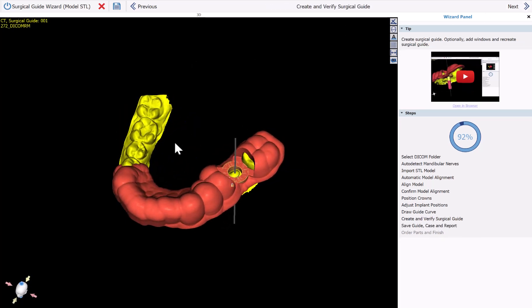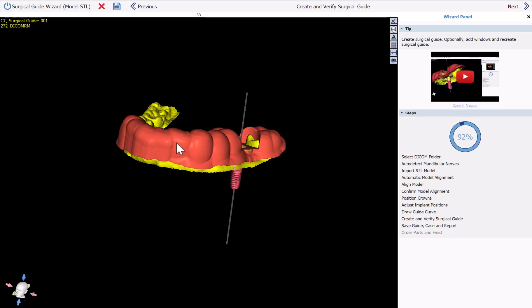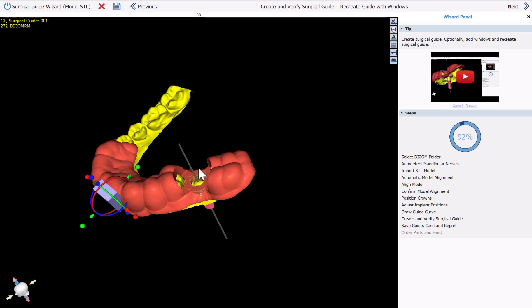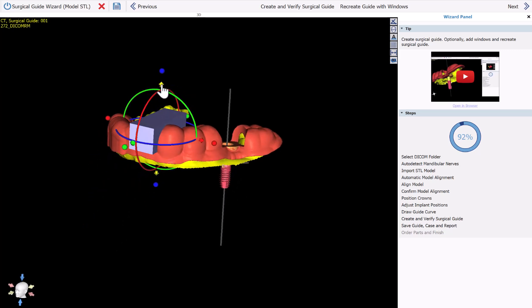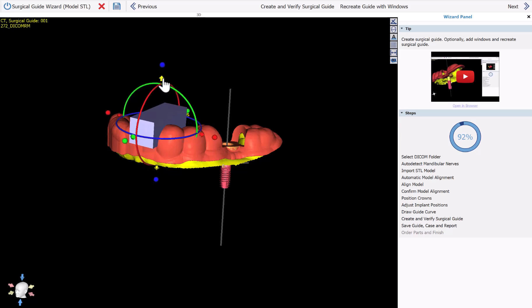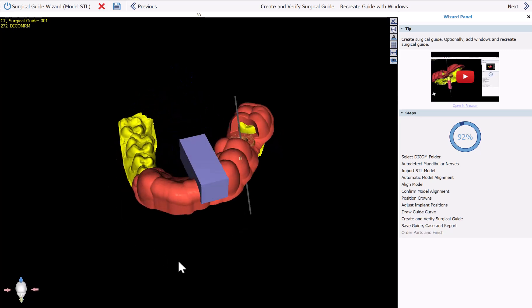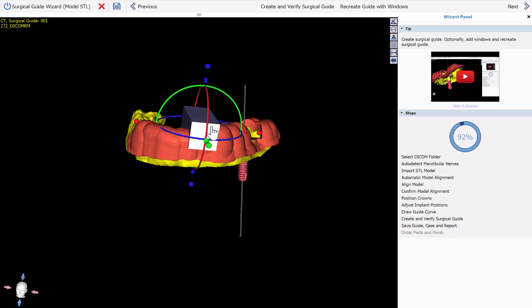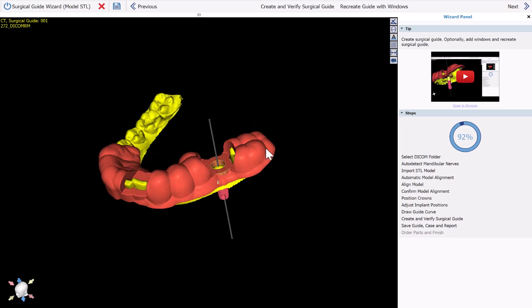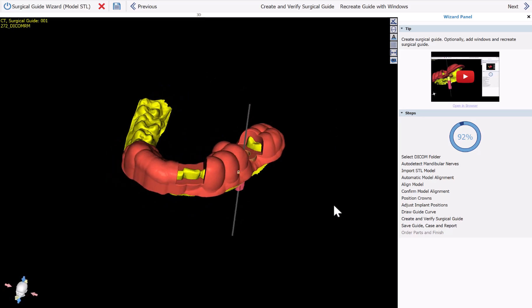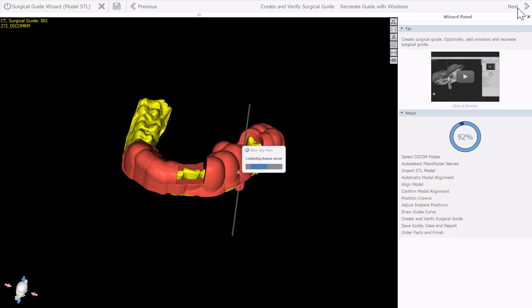Here we have the surgical guide that appears on our screen. If we want to add a window, right-click and choose Add Window. Customize the shape of the window by sizing and placing the box — make sure you have at least three millimeters in every direction of material — and once you're done with the window box, click Recreate Guide with Windows. Now we have our completed surgical guide.